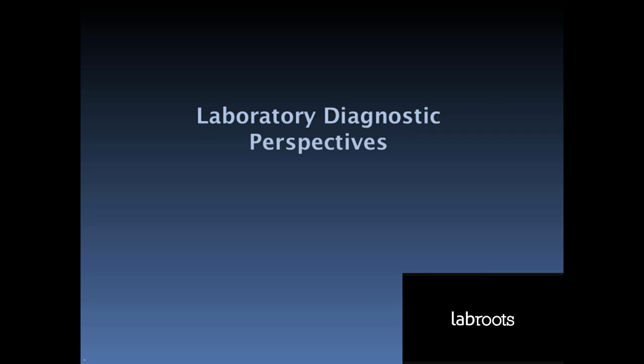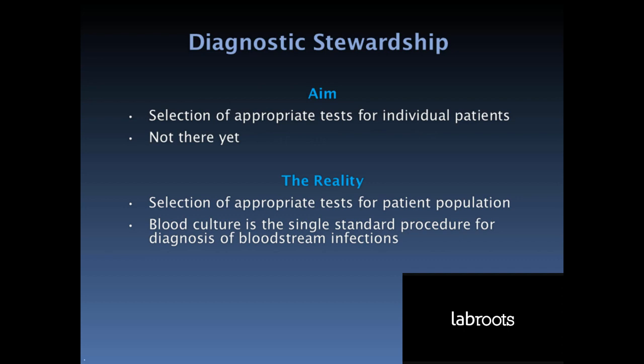When the laboratory investigates suspected sepsis, because of the high risk of death, it is absolutely essential to provide the best quality of service. Let's now look at the essential diagnostic perspectives. The first perspective is diagnostic stewardship. This term is integral to the management of sepsis. In the future, tests should be tailored to the treatment needs of individual patients.